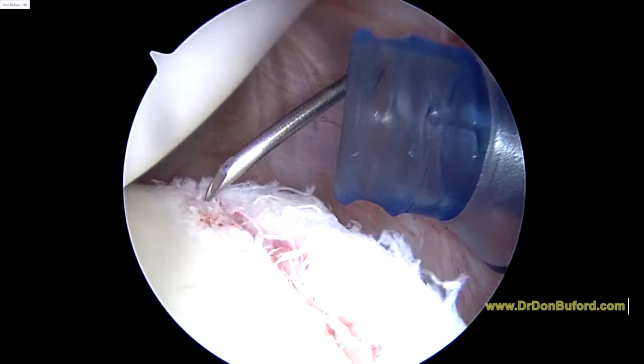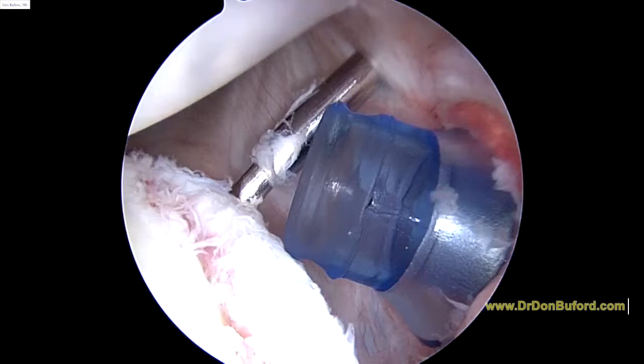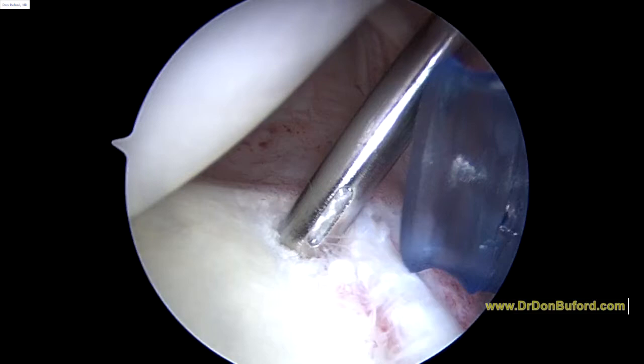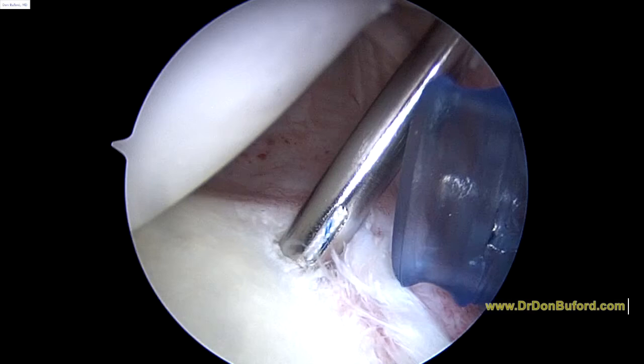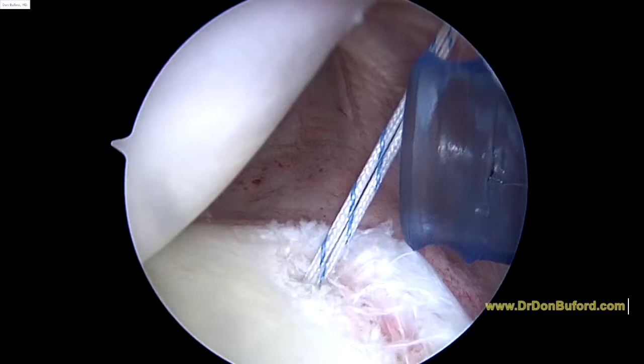Drill guide coming in. Now we can use the tip of this to show you — we're going to be placing an anchor in here, probably a second anchor up here, to stabilize that. So we're just taking the anchor down next to the bone. This particular anchor is made out of suture material, so there's no metal or plastic. We have to seat the anchor by pulling tight on it, fast. And now we have two good sutures to work with.